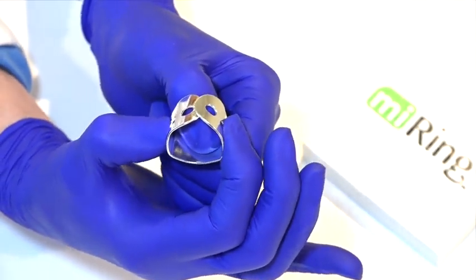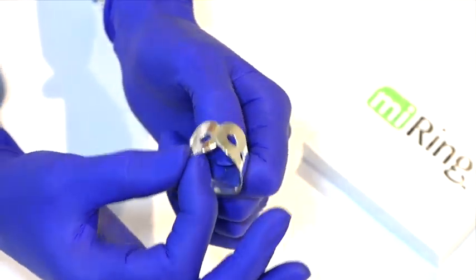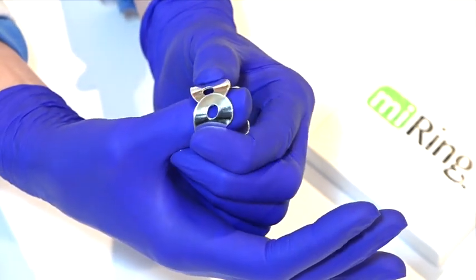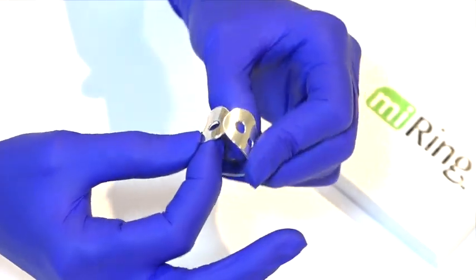You can adjust myring to different thumb sizes by pushing slightly in on the sides or pulling them apart for a bigger thumb.